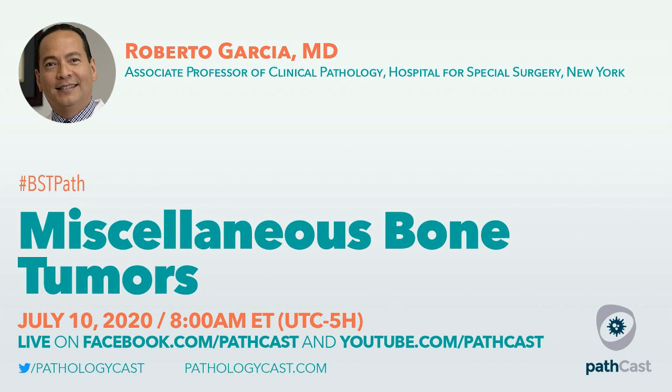Like the picture that I showed you during the lecture, what you see is basically hyalinization and sclerosis of the stroma, or fibrosis of the stroma, many times just myxoid change and scattered inflammatory cells. And if anything, you may see some occasional surviving cells here and there that look so distorted that the likelihood of those being viable is low. So yeah, but there are no other histological parameters that I could really recall that are used for impacting prognosis.